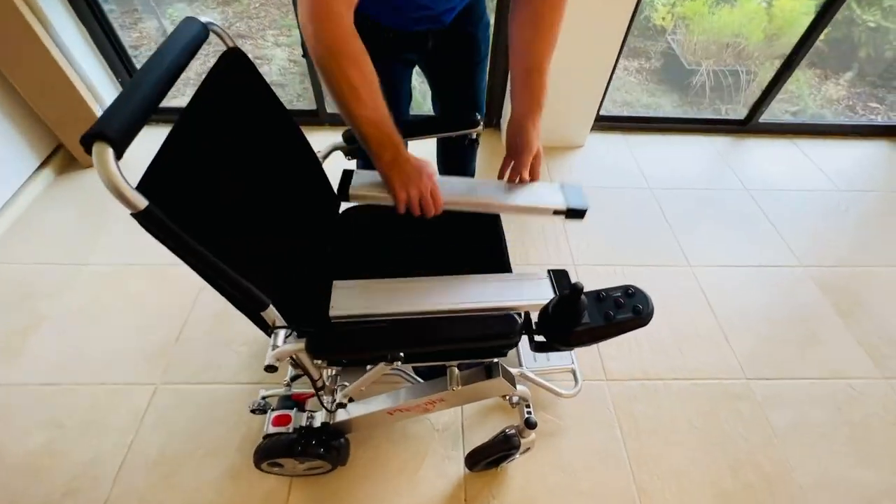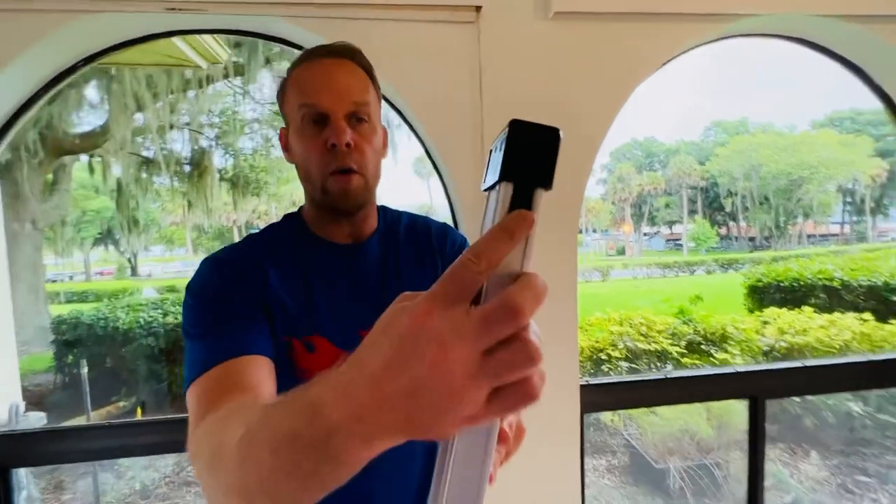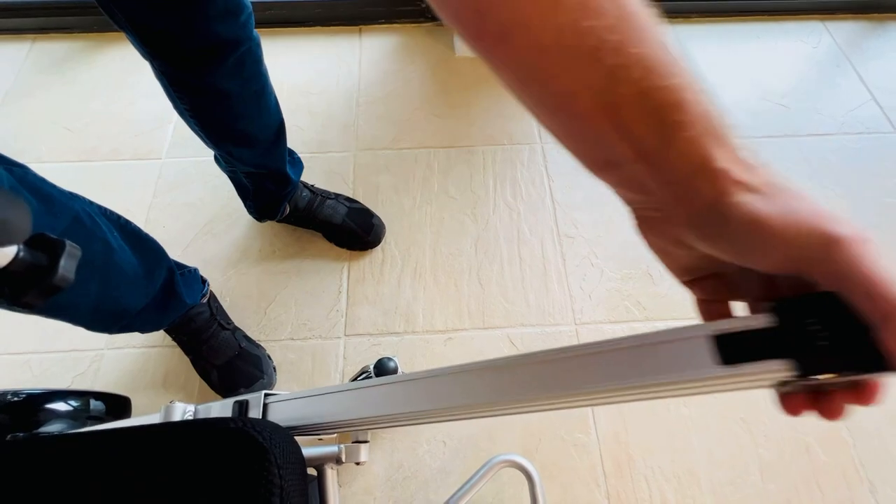If I want to put the batteries in, I make certain that the latch is up. You can see that there's no latch on the bottom side of the battery, and I simply slide the battery back into the frame of the chair.